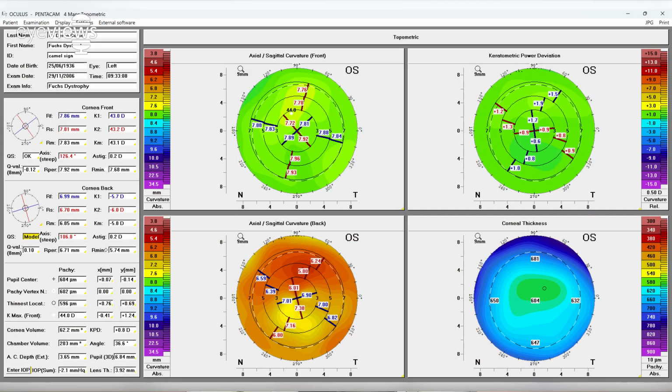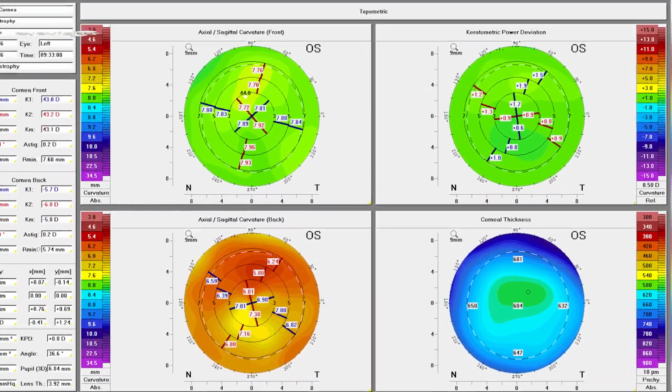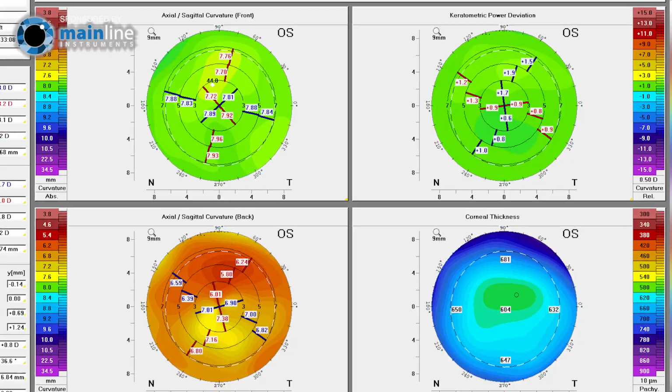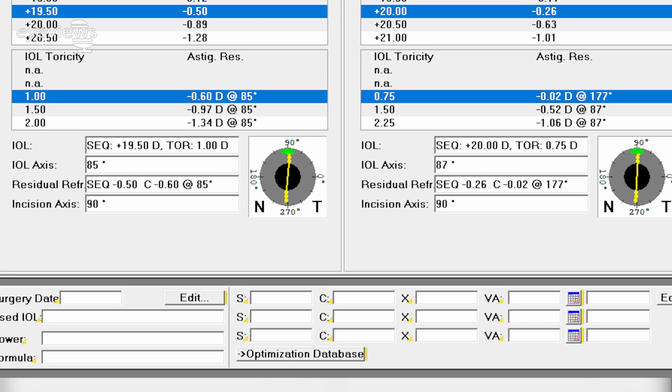And what's the importance of looking at the posterior corneal surface and also the implications it may have on your treatment? It's critically important, and we know that we need to consider the posterior surface of the cornea and the posterior curvature for many things, not just for assessing the health of a cornea before refractive surgery, but also in the calculation for IOL. So for planning lens surgery, whether we're treating a patient with cataract or whether we're doing a refractive lens exchange or whether we're going to do a phaco for presbyopic correction.